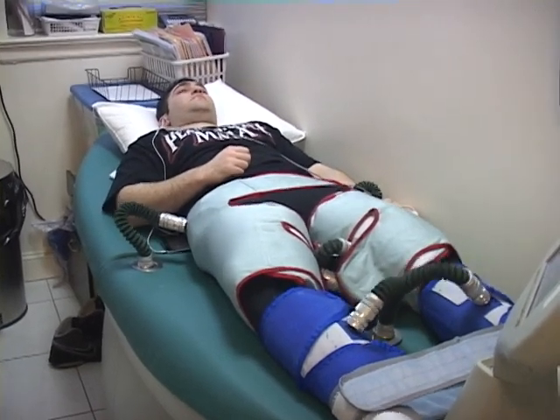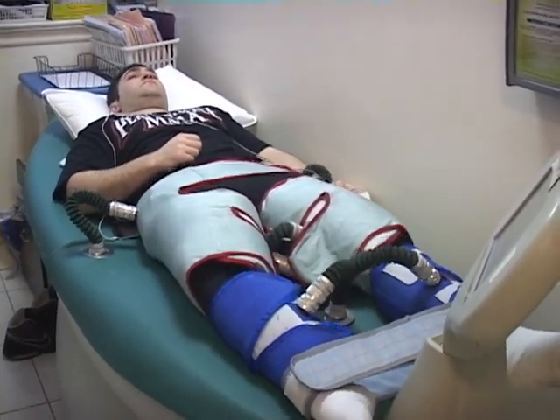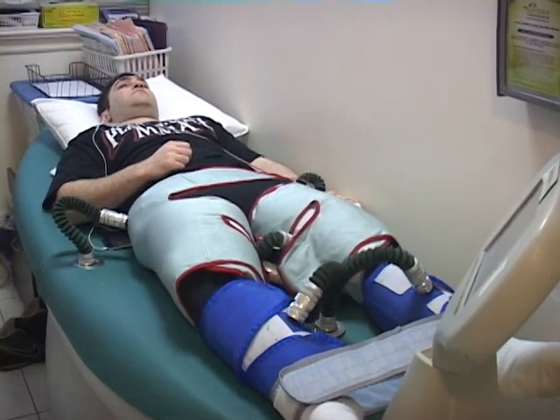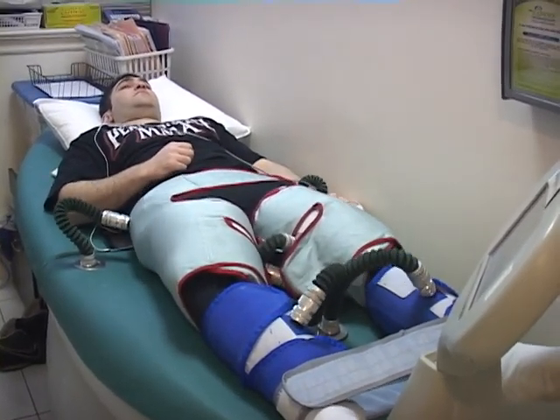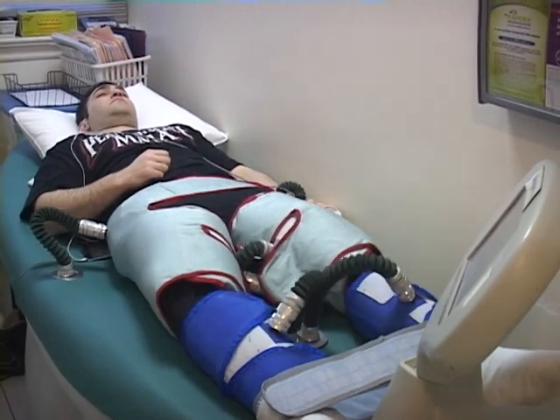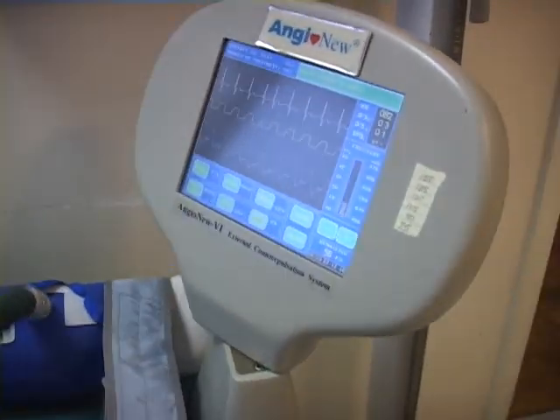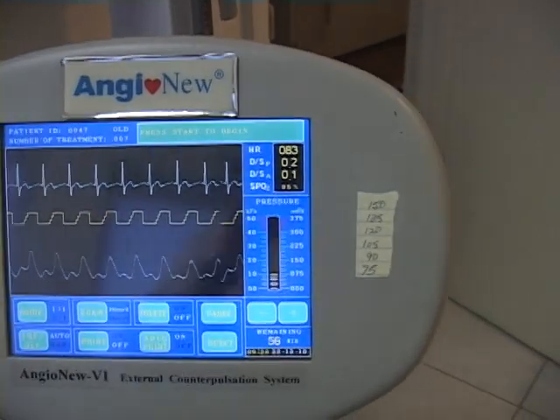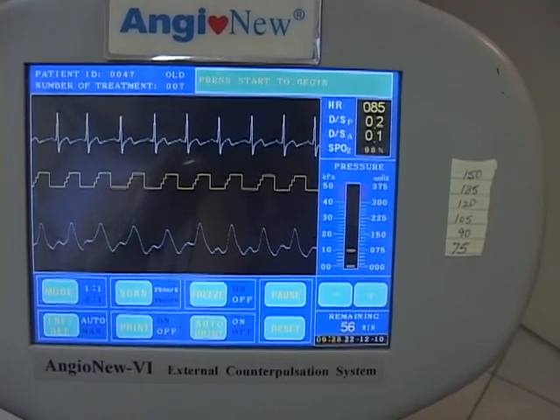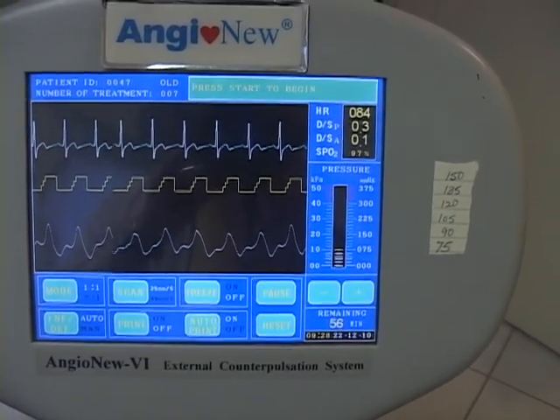This is EECP, External Counterpulsation, where the actual heart is filled with blood by these cuffs pumping blood from the lower extremities and lower abdomen into the right atrium. It actually occurs during diastole, and the heart is monitored by EKG probes. As we can see on the screen, the counterpulsation occurs in between the heart contracting — that is, in diastole.